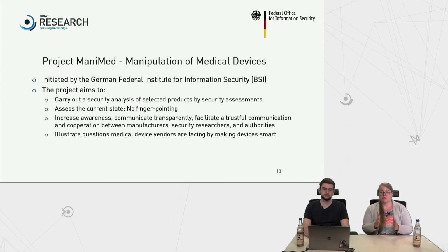To further restrict our market research, because we cannot test every device on the German market, I asked for additional requirements, and these are the following. The devices had to be no longer than 5 years on the German market, so quite new devices. They should be highly connected, having as many interfaces as possible for an appropriate attack surface.